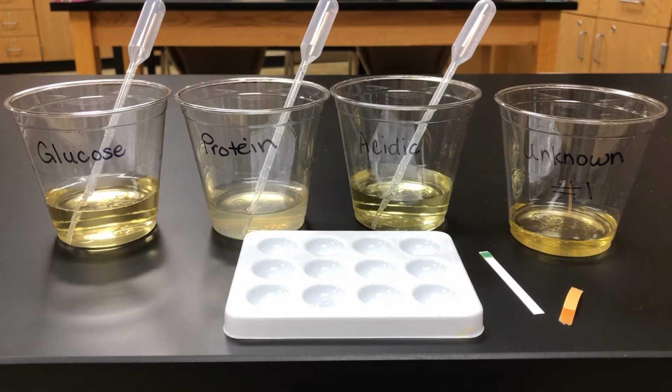Okay, so if we keep going, for part B it says to test the unknown. Number 1 says test your unknown sample of urine to determine which of these substances is located in your urine sample: glucose, protein, acid, or a combination of these. So now we're going to place approximately 5 drops of urine in 3 different wells of your well plate. And then we're going to test each of the wells for the substances in part A and record the results below.